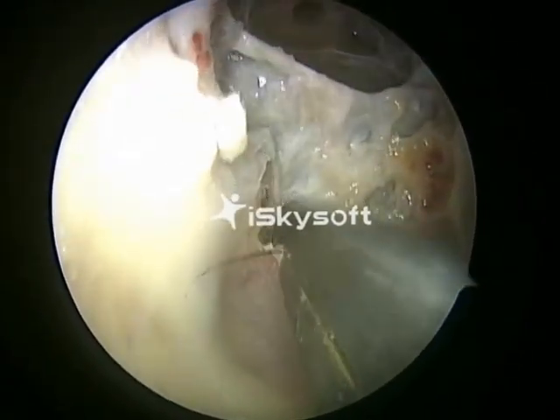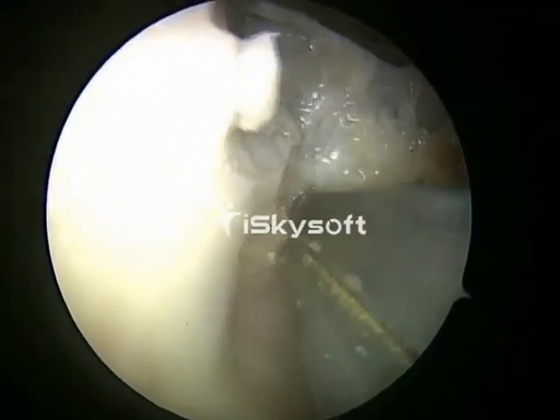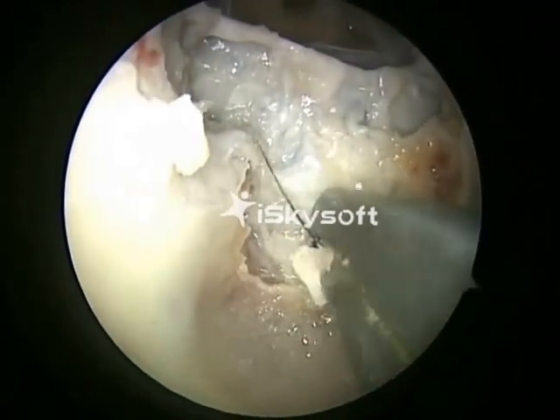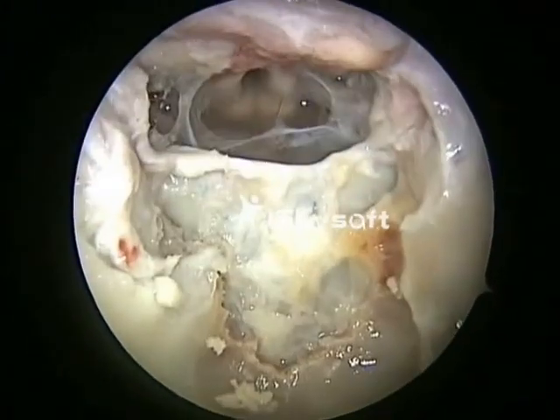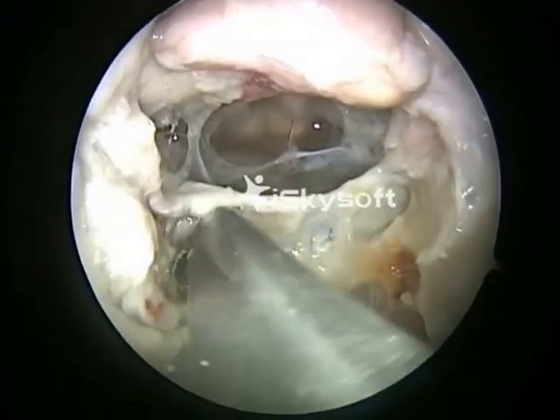We should not go too laterally while dissecting the bone. The Vidian nerve is a fantastic landmark for identifying the carotid artery. That's the carotid on either side.